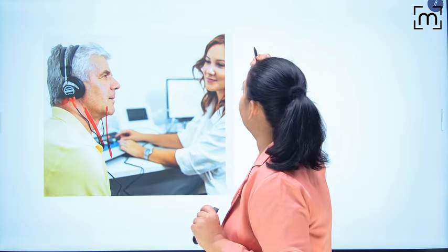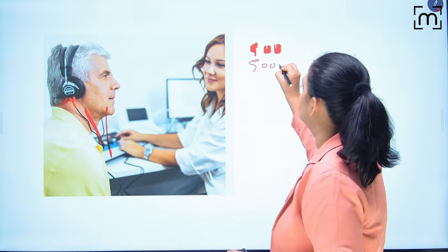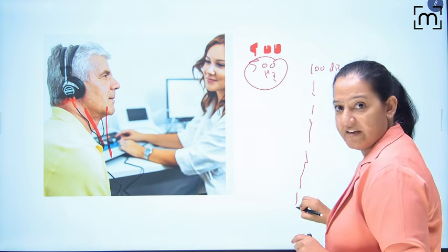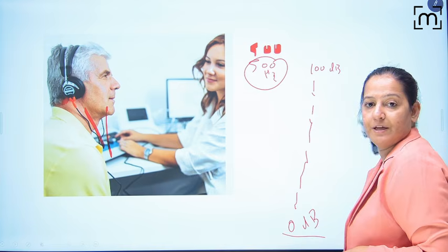Suppose we are testing at 500 hertz. This is my frequency. I start with 100 decibels and I keep on reducing in intervals of 5 till 0 decibel. If the patient has no hearing loss, the patient can still hear at 0.